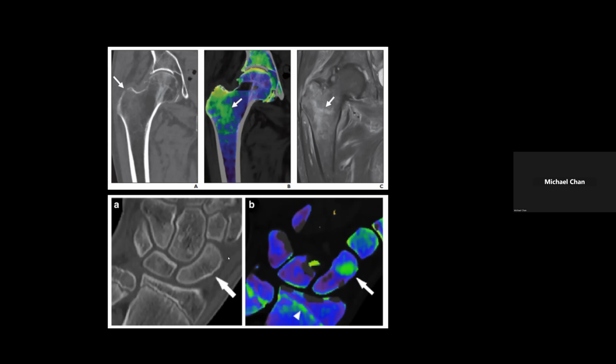On the bottom, we have a CT of the wrist. And in the scaphoid, you don't really see a clear fracture line. But on the bone marrow edema map, you can see that there's clear edema in this region, which should encourage the radiologist to interrogate this area closer and look for a very subtle occult fracture.